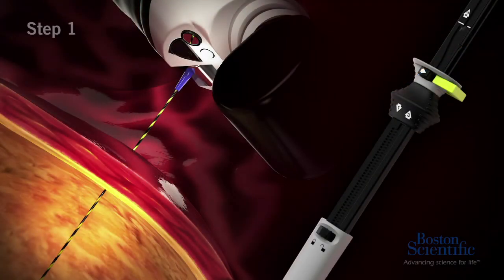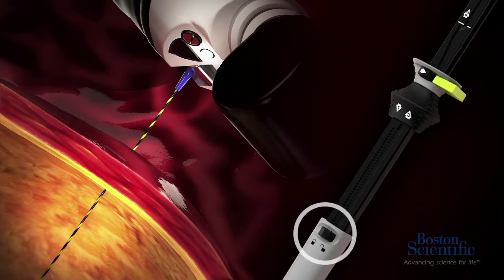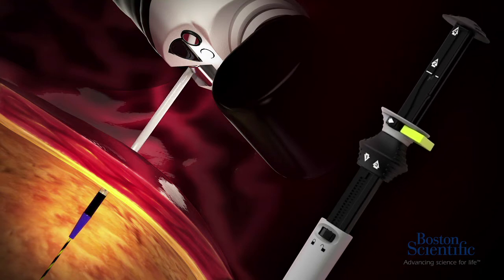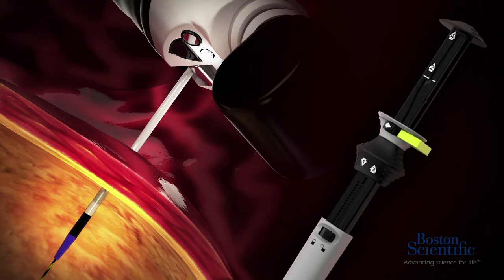Step number one. Under EUS guidance, advance the catheter into the cyst by unlocking the catheter lock and moving the catheter control hub downward until the distal catheter is in the desired location within the cyst. Lock the catheter lock.